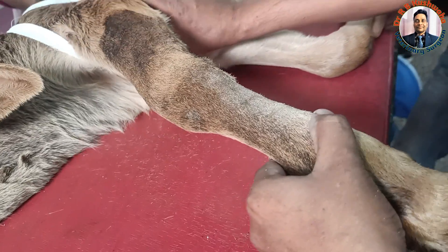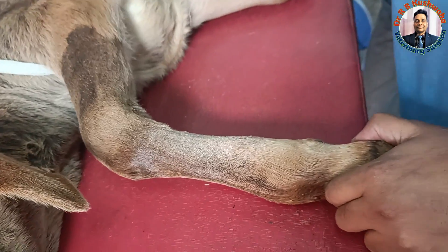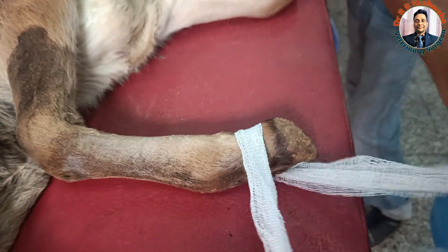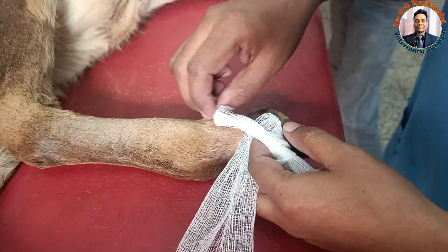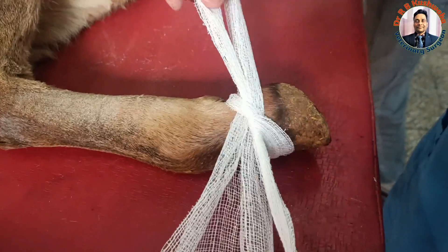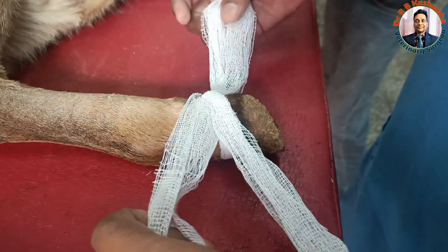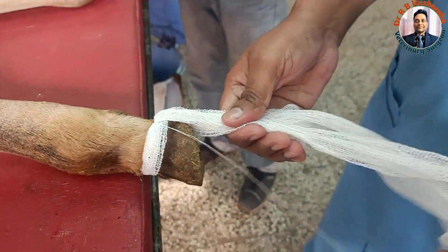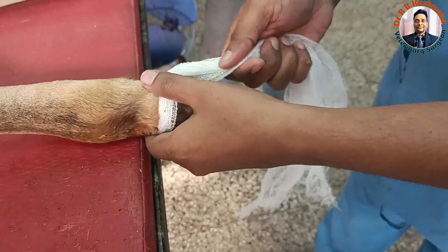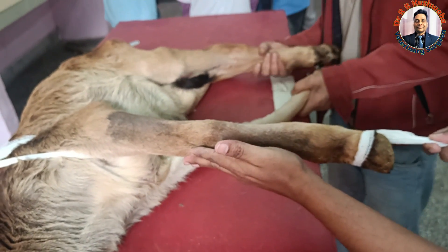For the plaster of Paris cast, we have applied one bandage at the ungular region. This bandage will act for traction and counter-traction. The lower bandage is tied like a slip knot, kept in position, and after completion of the procedure it is removed by pulling the knot out from outside.